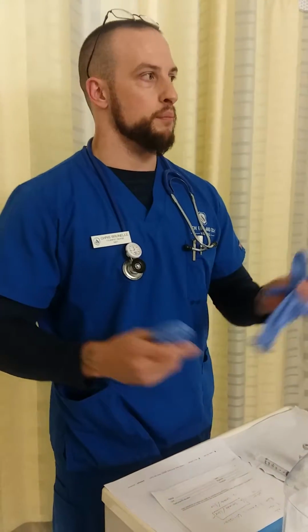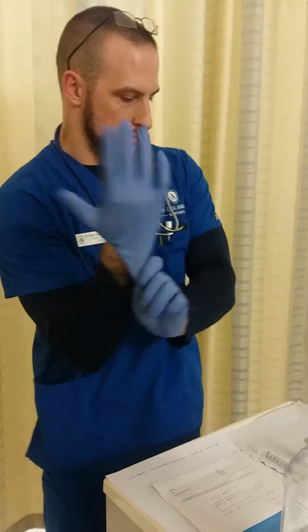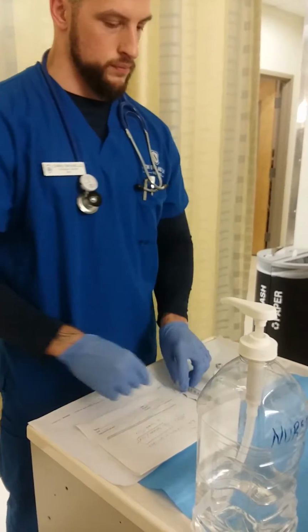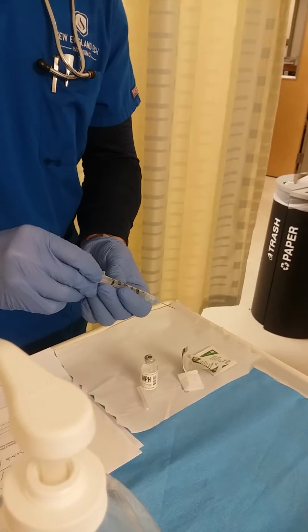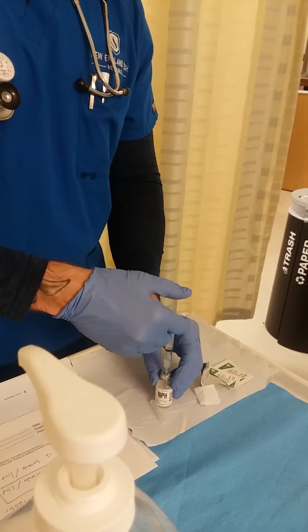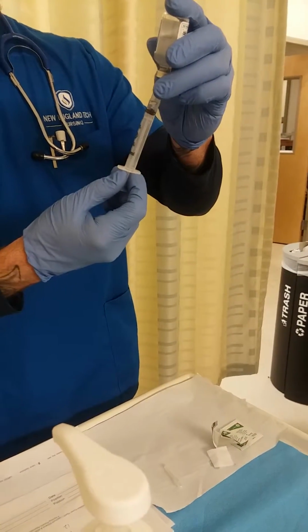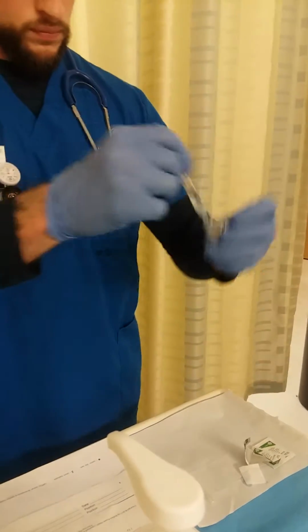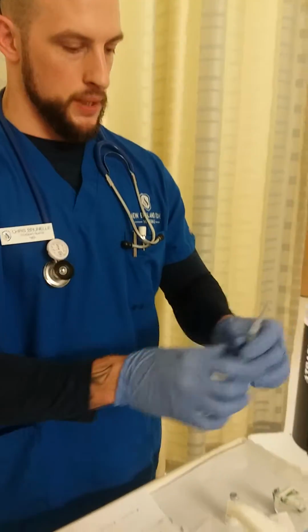I've already performed hand hygiene, and I'm going to put gloves on as well. I'm using an alcohol prep pad on the top of the vial. So now I have my 1 milliliter syringe with the correct medication in it.